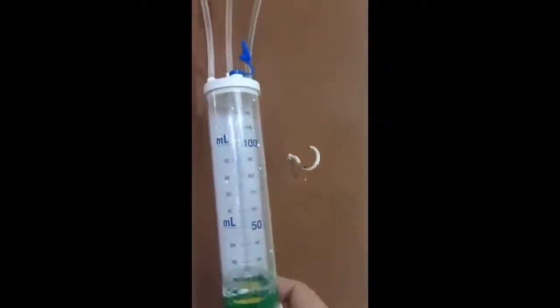When the drug is consumed, add more 20 cc of IV fluid to the Soluset for flushing to ensure complete administration of the drug. This is to ensure that all medication clears the tubing. And then close the main line, then open the Soluset up to 30 ml, then close the airway. Regulate according to physician's order, OSCAR. It means open Soluset, close airway, and then regulate according to physician's order. It maintains the patent primary IV fluid.